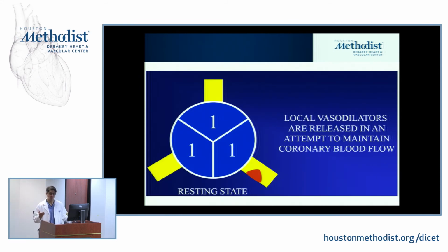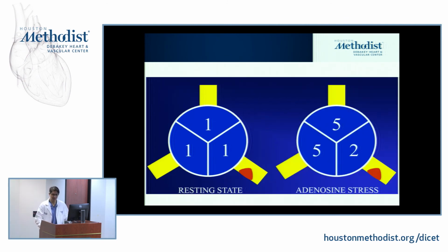And let me just take that one step further. Imagine this is the resting state, and let's say we're depositing radiotracers in proportion to blood flow. If you have a stenotic artery here and normal arteries here at rest, you should have equal deposition of radiotracer. Whereas look what happens in the case of stress. If this is a significant lesion, you are going to have a significant discrepancy in the amount of radiotracer that is deposited in the regions of the heart, comparing normal to those served by the stenotic artery.